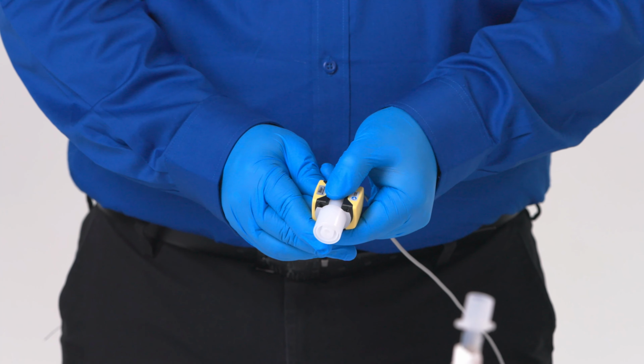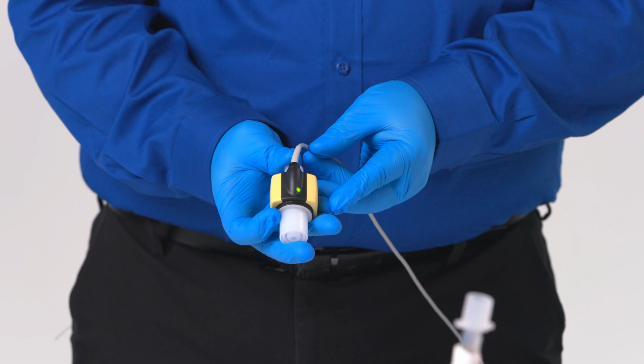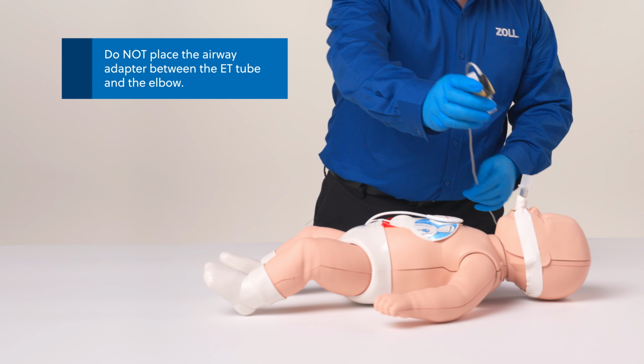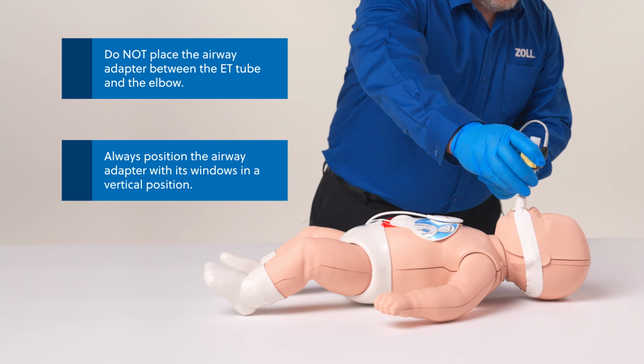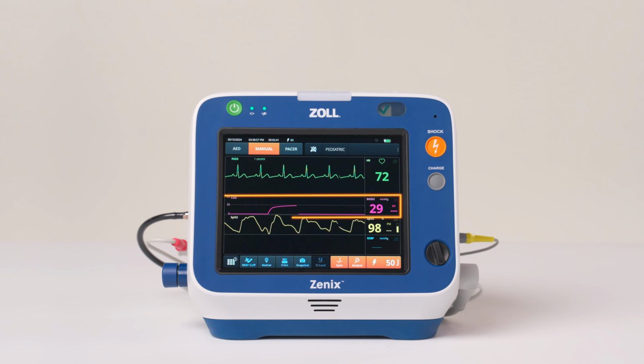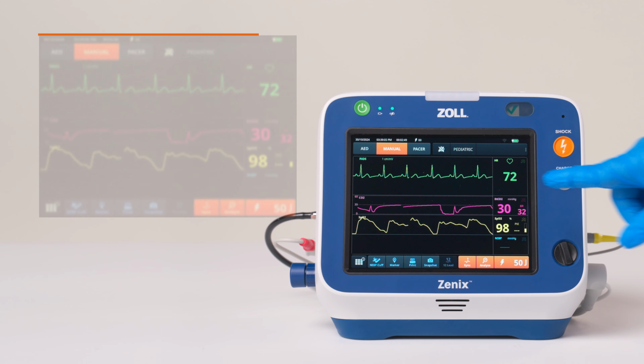A green LED indicates that the probe is ready for use. Attach the airway adapter to the circuit. The CO2 waveform and numeric value appear on the screen. Highlight and select the EtCO₂ numeric window to adjust general settings and alarms.